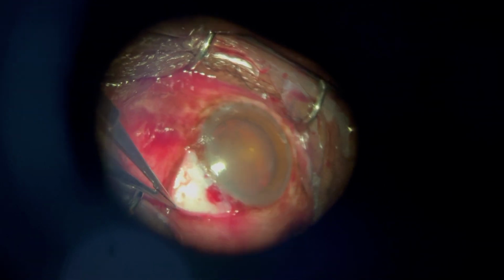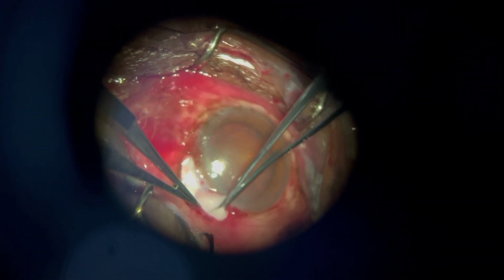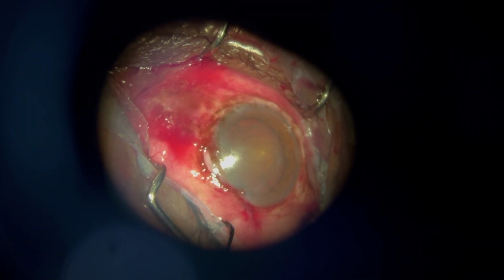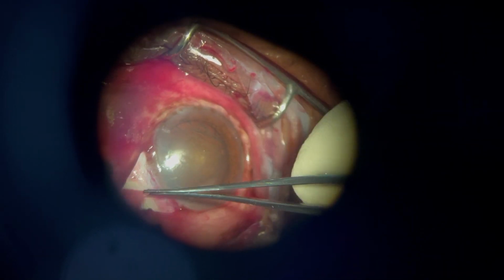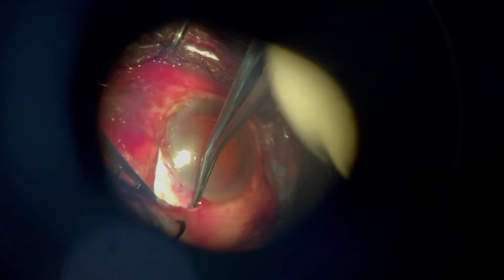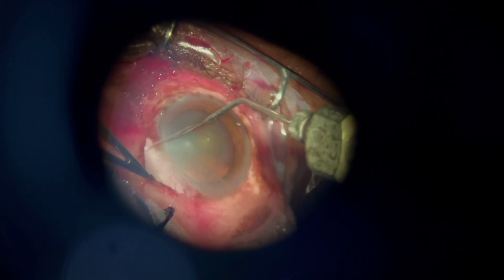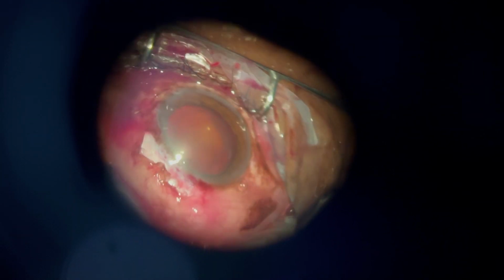If sponges are used, they are applied after peritomy, taking care not to touch the cut edges. Then the conjunctiva is retracted over the sponge. After 2 to 4 minutes of designated time, all the sponges are carefully removed and the area is washed thoroughly with 15 to 20 ml of balanced solution. Then the routine steps of trab are carried out.